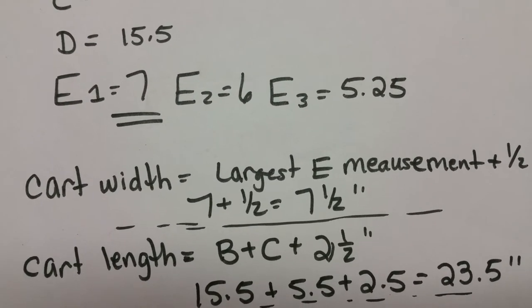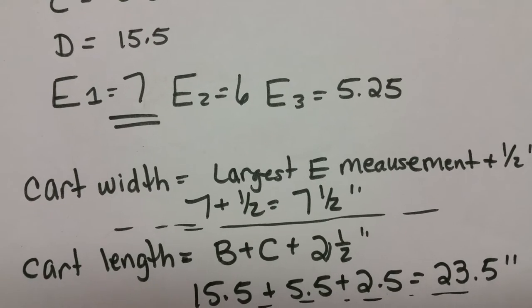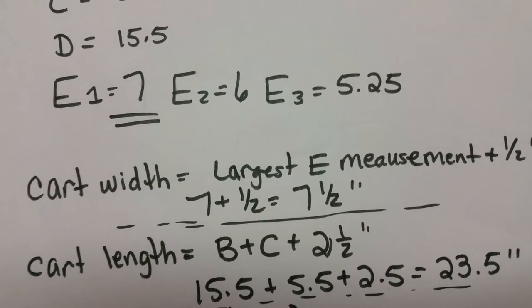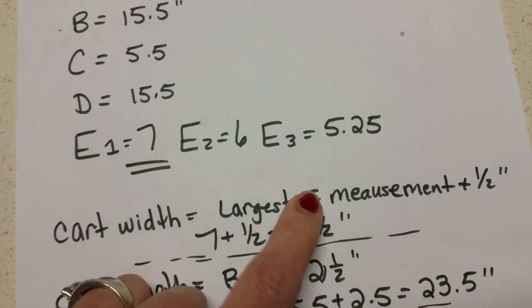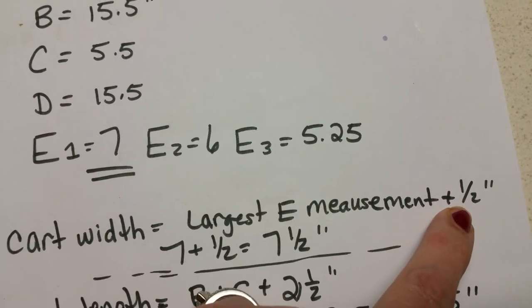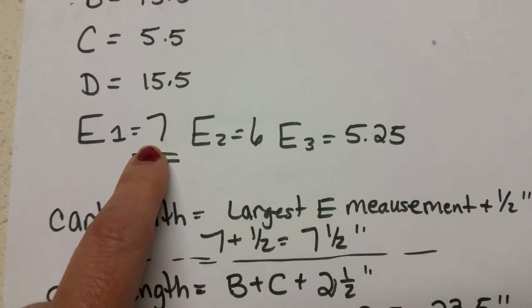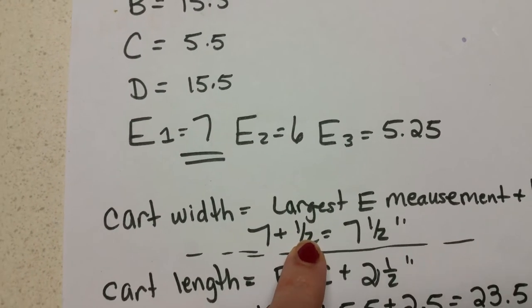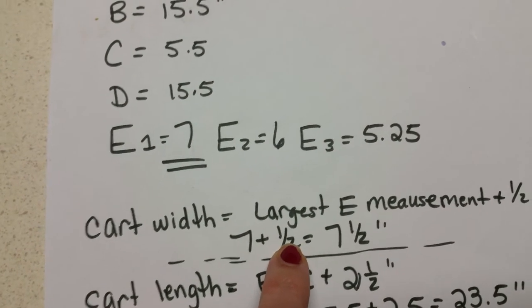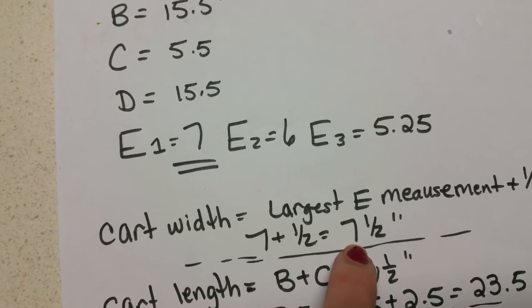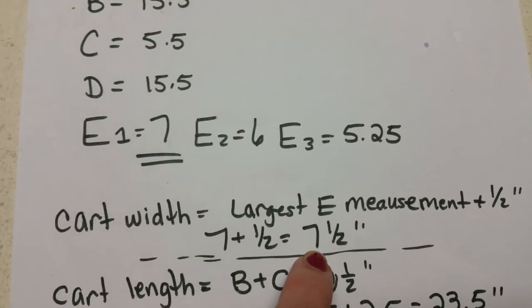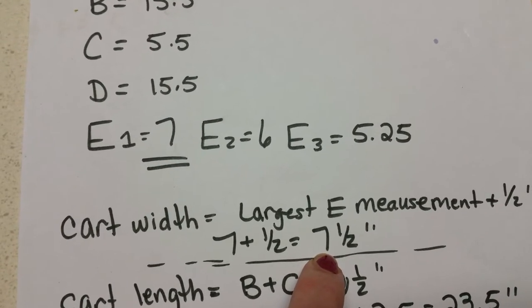Next we start figuring out the measurements we need for our cart. To figure out the cart width we take the largest E measurement and we add one half inch. So our largest E measurement was seven. We're going to add one half inch onto there because we don't want a lot of room but we want a little bit of room on each side, about a quarter inch of the dog, so that they're not smashed into their cart.